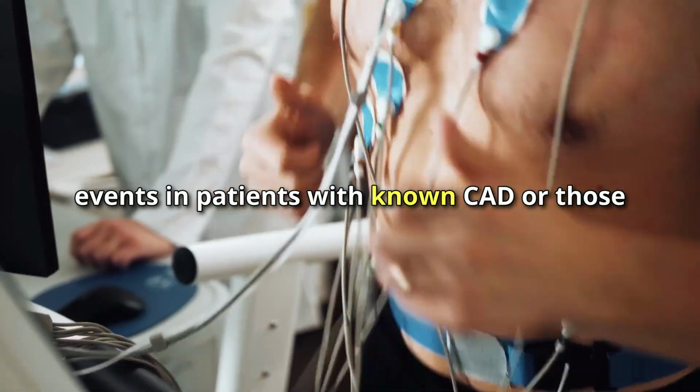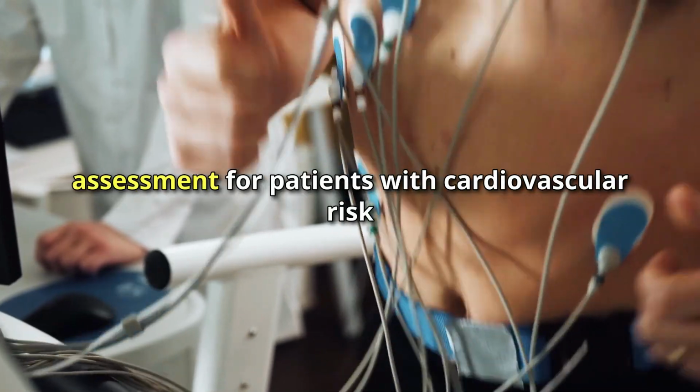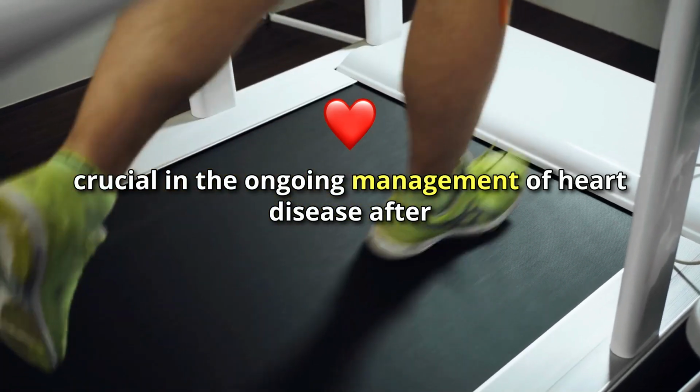It helps predict the likelihood of future cardiac events in patients with known CAD or those who have had a heart attack. It's also invaluable in preoperative risk assessment for patients with cardiovascular risk factors undergoing non-cardiac surgery. DSE is not only a diagnostic tool but also crucial in the ongoing management of heart disease.